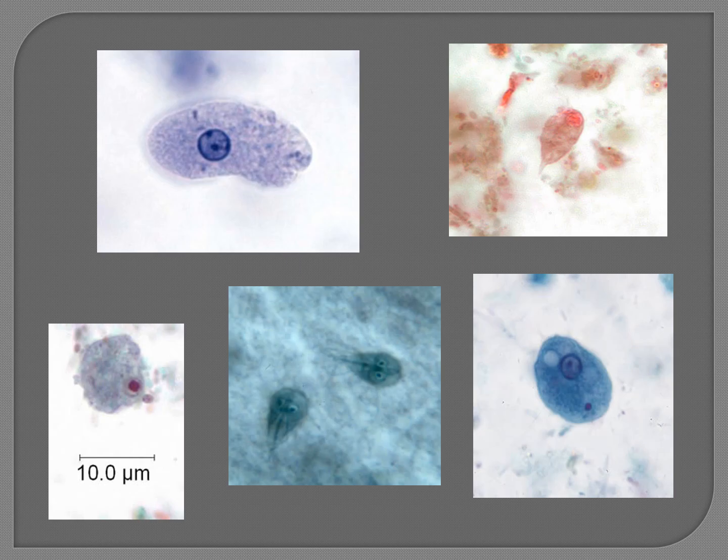And then finally, on the bottom right, we've got Entamoeba coli. And you can see that the cytoplasm is very dense. We can see that the protozoan is not very motile. It's very bubbly looking and dark. And you can see that the peripheral chromatin is uneven and kind of chunky. So these are some examples of the protozoan trophs that I'd like you to know.